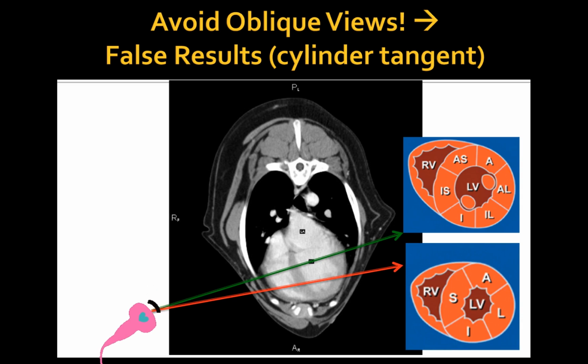By obtaining an oblique view in a dog with impaired LV function, it may be misinterpreted as normal or even hyperdynamic. Therefore, it is important to visualize the papillary muscles and to acquire the classic mushroom view when interpreting LV function in the right parasternal short axis view.